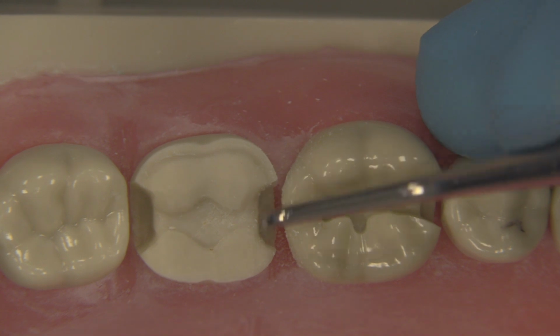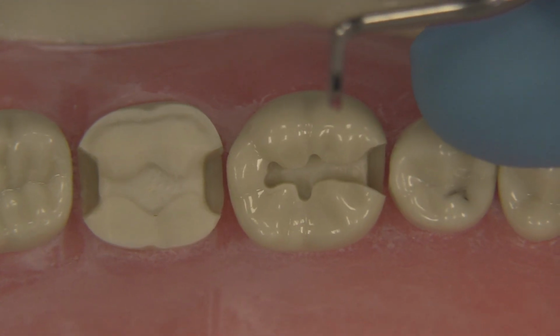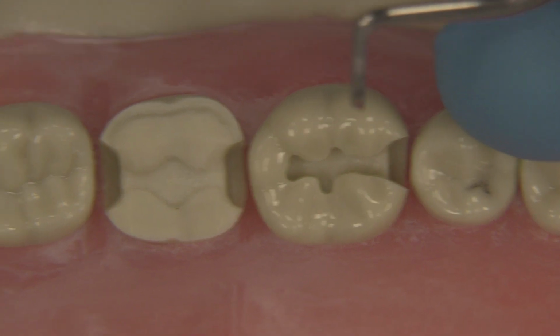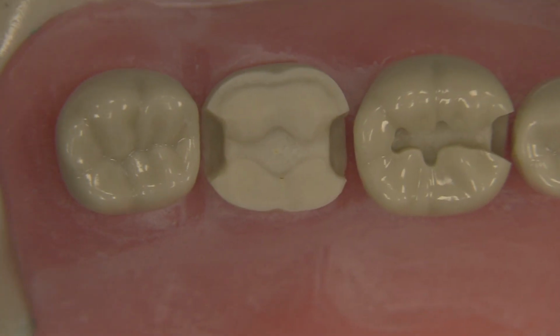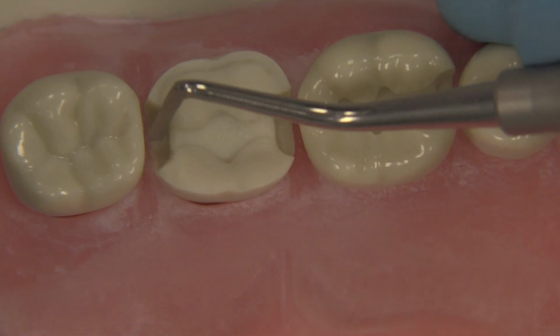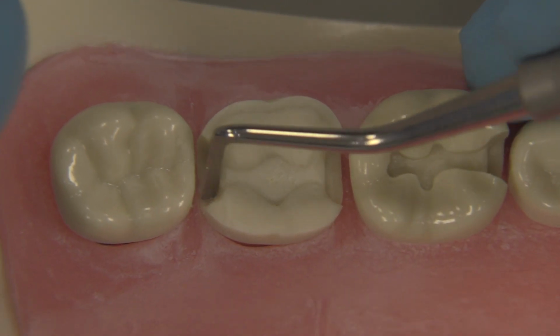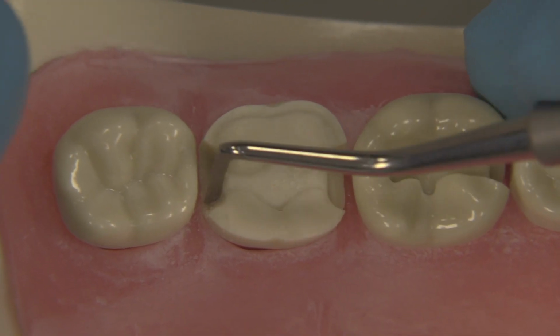So you can start to make that box pretty spectacular. And then you can do the same thing on the distal. Once again, holding the instrument in there, try to get the whole wall rather than just the edge. And that works out pretty well.